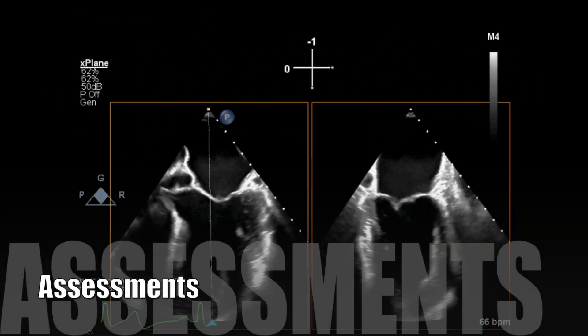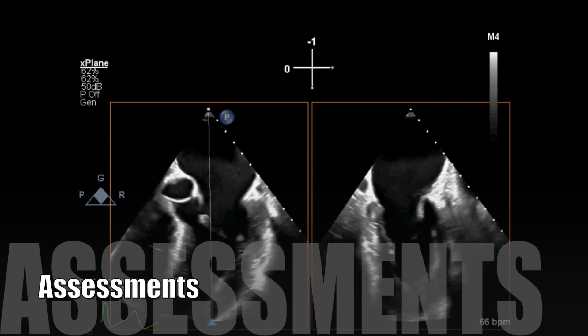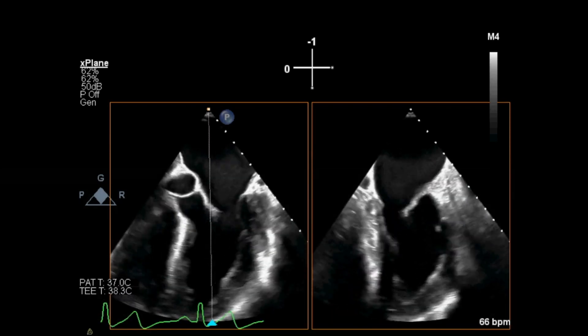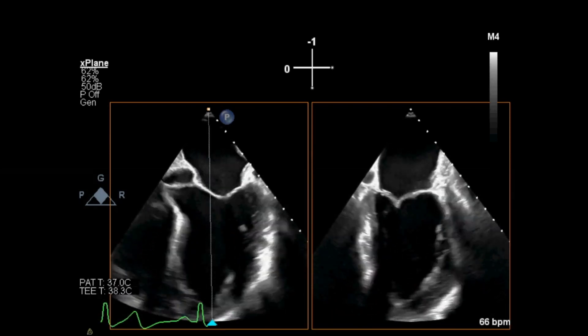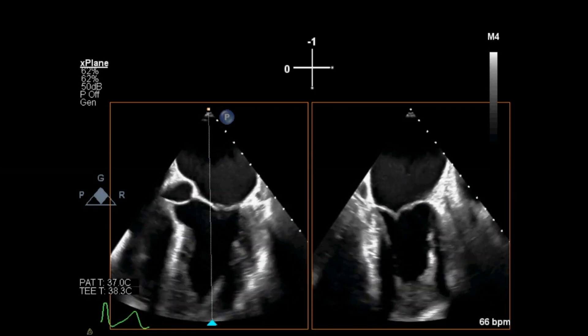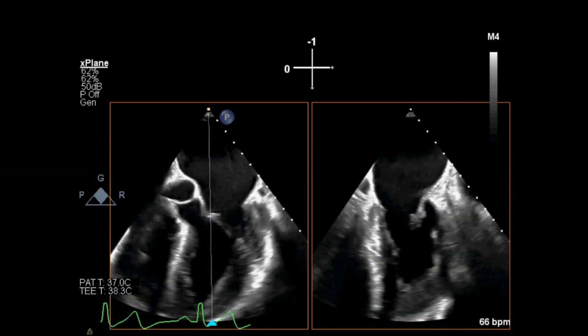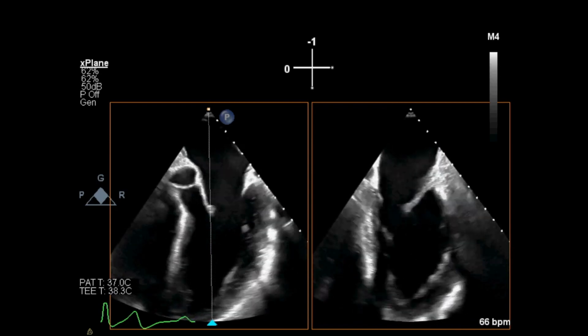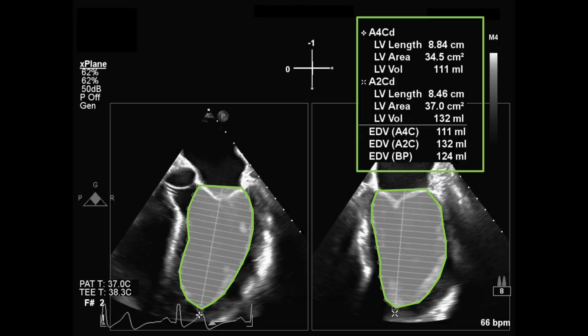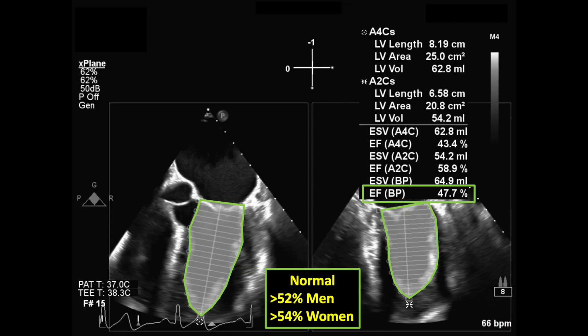Going back to these views, I calculate the left ventricle's ejection fraction by the Simpson's method from the biplane video clip at end diastole and end systole, and do the same in 3D.